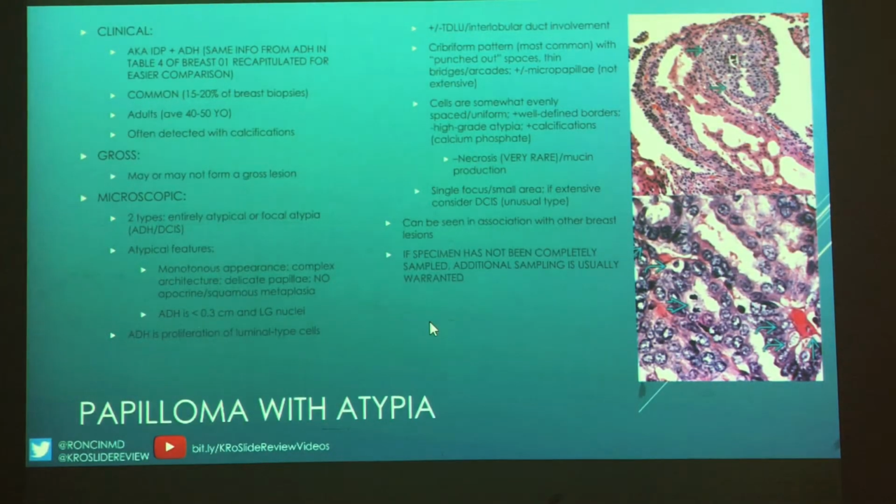Alright, so this is also known as intraductal papilloma with ADH. Pretty much all the information that's on here and a lot of what's in your handout is going to be the same as the ADH stuff that we had from last time, because it's just a reminder of what constitutes ADH. Okay?